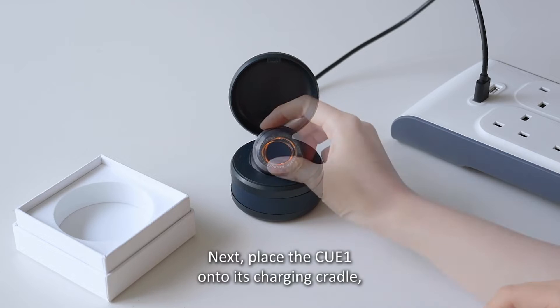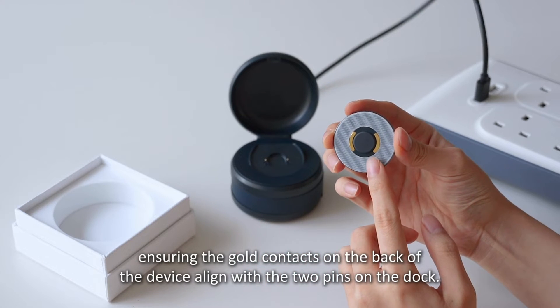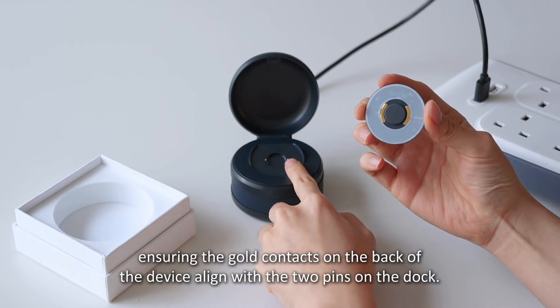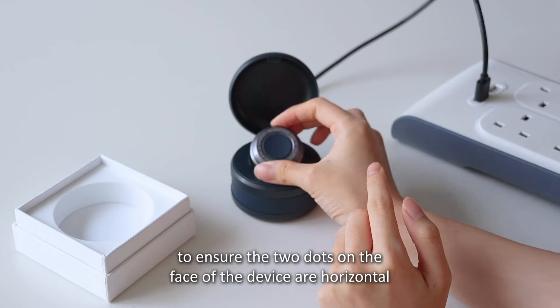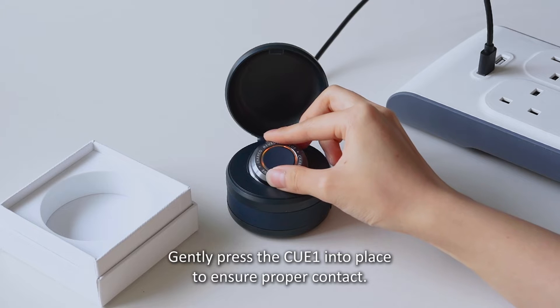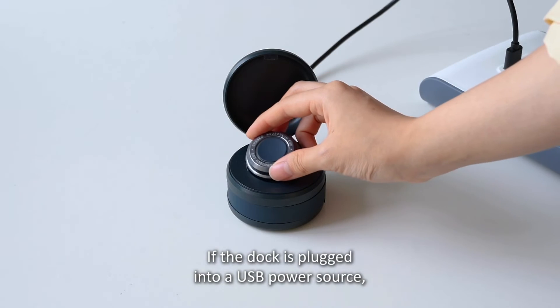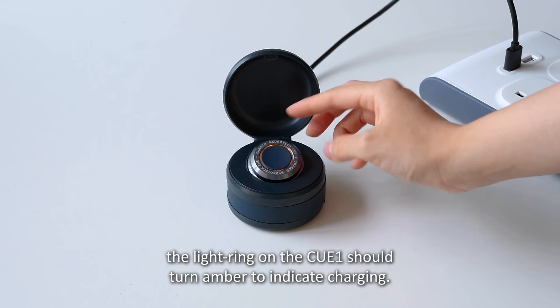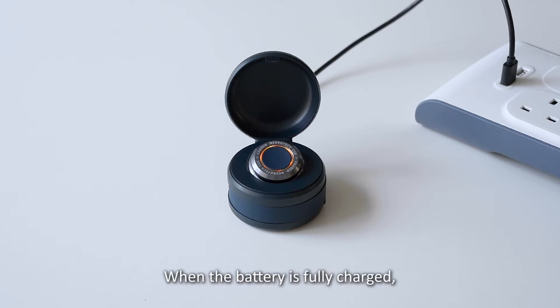Next, place the CUE1 onto its charging cradle, ensuring the gold contacts on the back of the device align with the two pins on the dock. A simple way to do this is to ensure the two dots on the face of the device are horizontal when placed on the dock. Gently press the CUE1 into place to ensure proper contact. If the dock is plugged into a USB power source, the light ring on the CUE1 should turn amber to indicate charging. When the battery is fully charged, the ring will turn green.